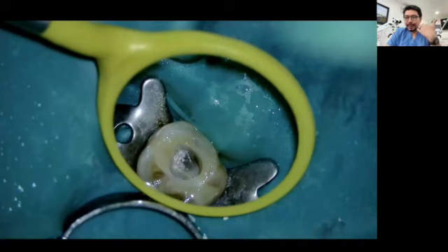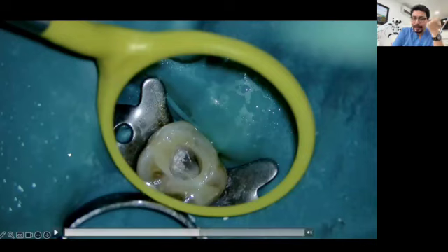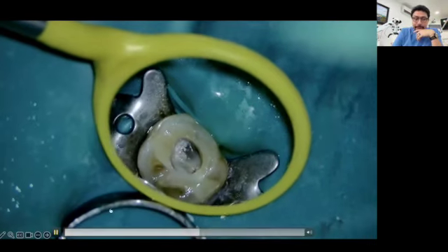It's possible to have direct vision even in the upper arch. You just need to ask the patient to move the head backwards and to angulate the microscope in that direction. You can do it to the palatal side, to the buccal side, to the lingual side, in almost any direction. That's why when we are performing surgery, this microscope is so convenient and easy to apply.